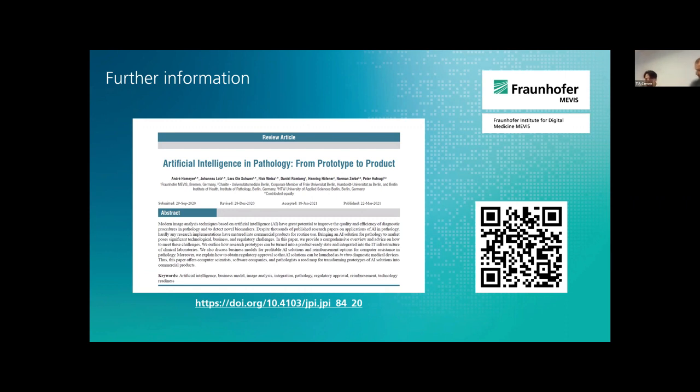With real world data, you cannot really control or measure that. Whereas with synthetically generated data, you can actually benchmark that, right? So you can, for example, have a certain data set, add small bits of blur to those images and calculate how well the product performs until which level of distortion. So this kind of use cases of synthetic data, I think they can be used.